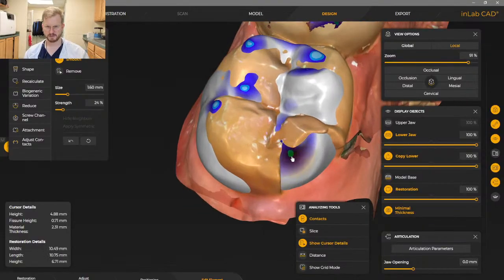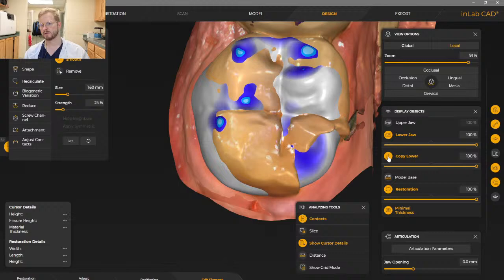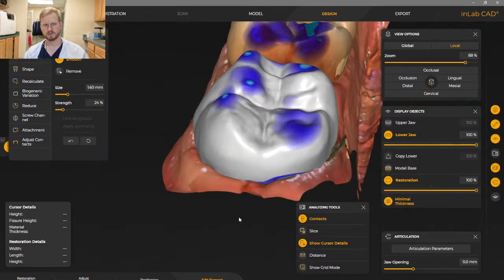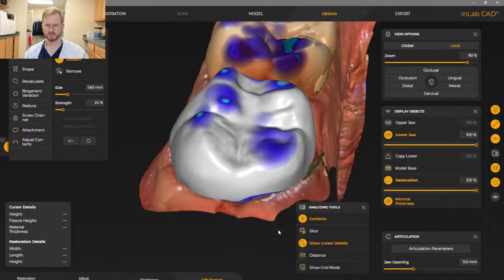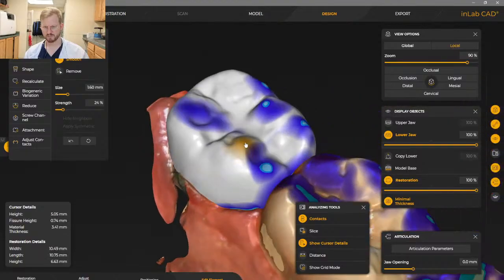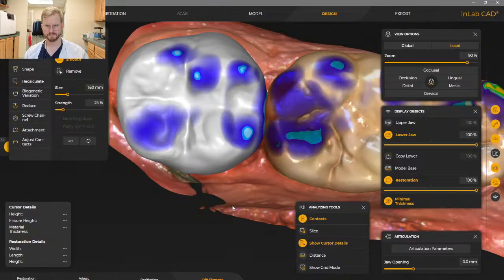I'm going to get rid of this. This is where he fractured that cusp. Also don't want that distal incline to encourage that tooth to walk backwards. So that's gone. That occlusion is looking better. We smooth this so that cusp is less prominent. Smooth that some. Okay. Occlusion looks good now.